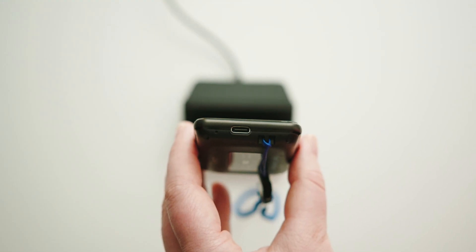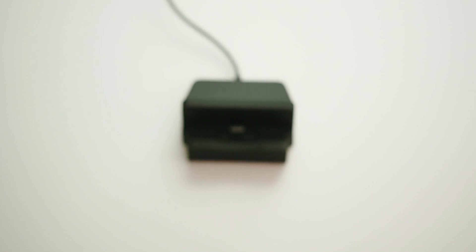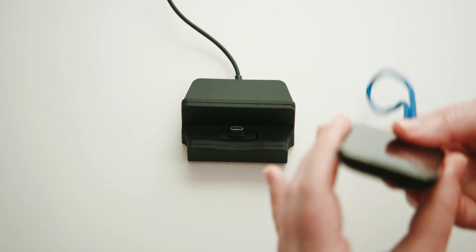Once the docking station is plugged into an outlet, match the micro USB port on the Link Plus to the micro USB plug on the docking station in order to secure the device.